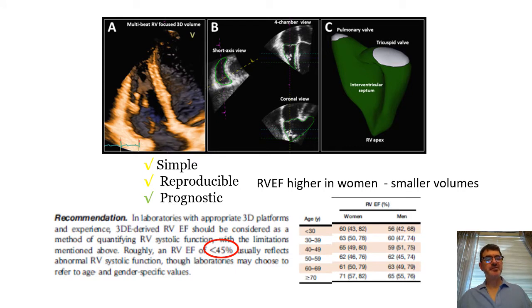Three-dimensional echocardiography promises to overcome the anatomic limitations of 2D echo as it applies to the RV's complex geometry. While newer generation analysis software simplifies the process, there's still a significant learning curve, and the analytic packages are dependent on image quality. Published literature on AI algorithms showed limited ability for the analysis to be truly automated.